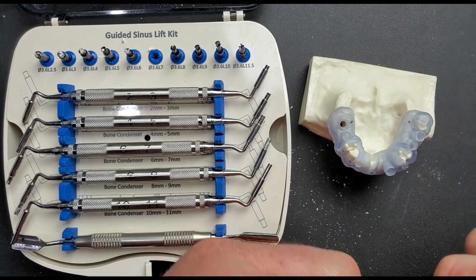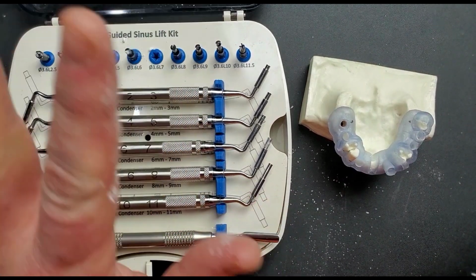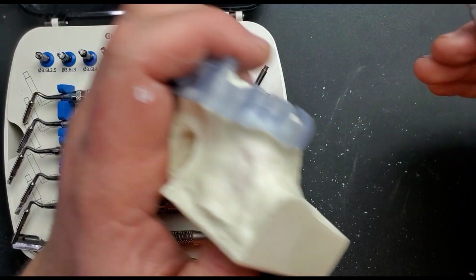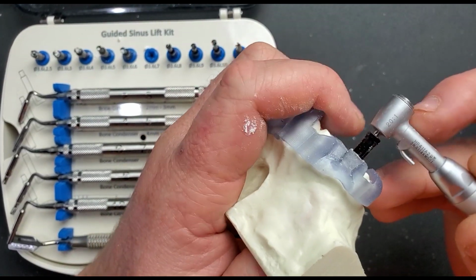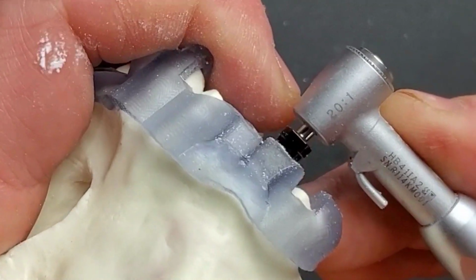So this would be where if I was doing this on a real patient, I would have probably just blown through those drills without doing a whole lot of checking, because I know I'm not going to get to the sinus membrane. But now as we're getting close, this is where you really slow down and want to evaluate whether or not you are through the membrane.